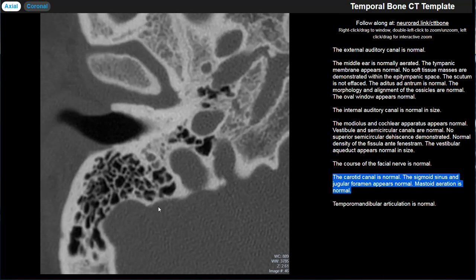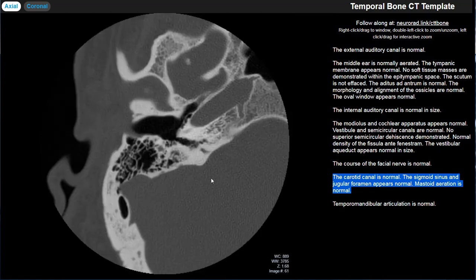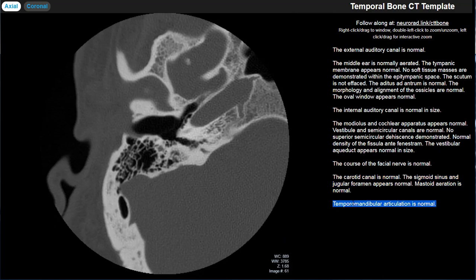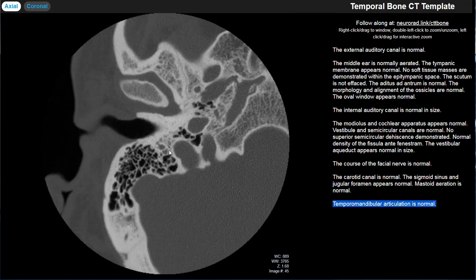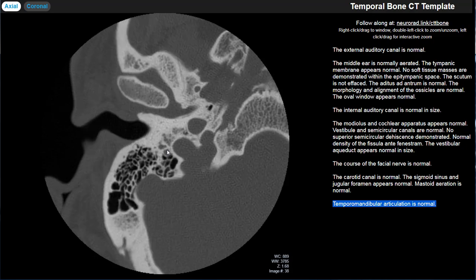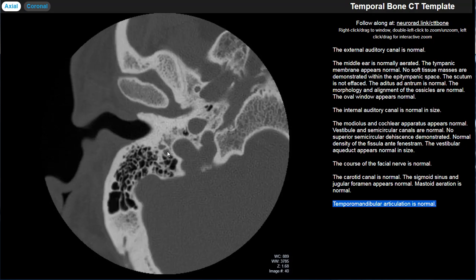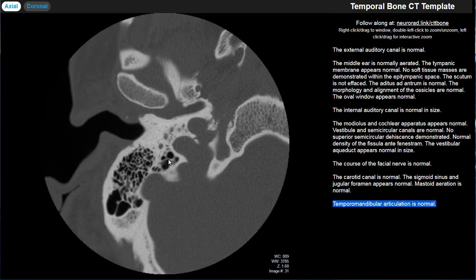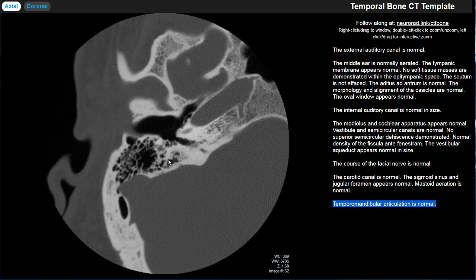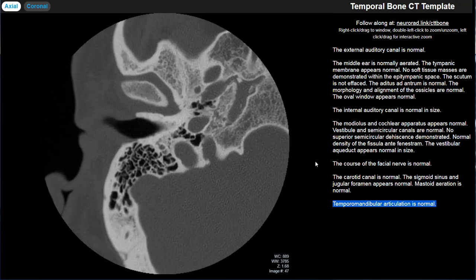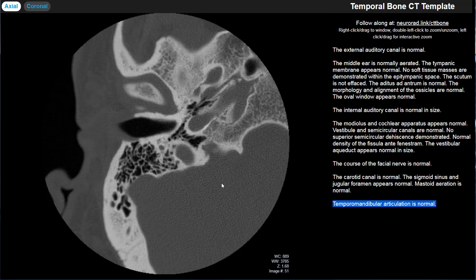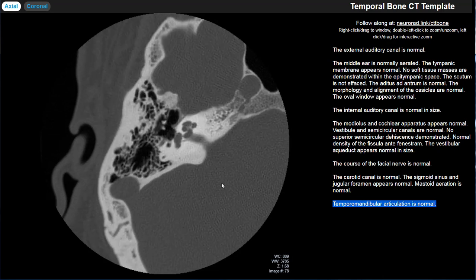I also comment on mastoid aeration as a final point. The last thing I discuss is the temporomandibular joint — noting any arthritis that might be occurring there, since someone may have symptoms referable to their temporal bone that are actually due to TMJ osteoarthritis. That covers most of the structures I evaluate routinely on every CT of the temporal bones.